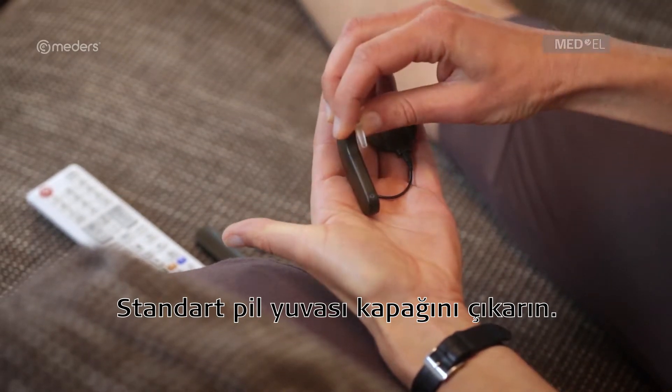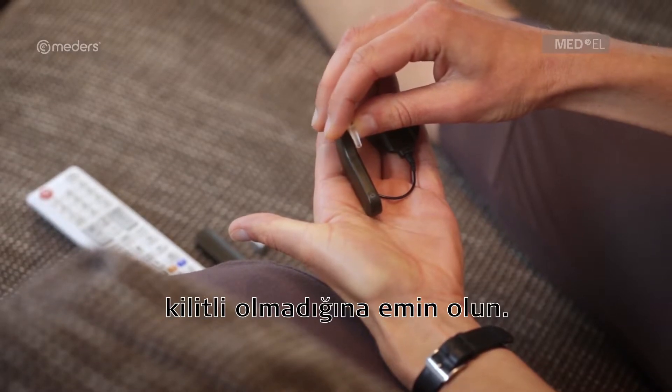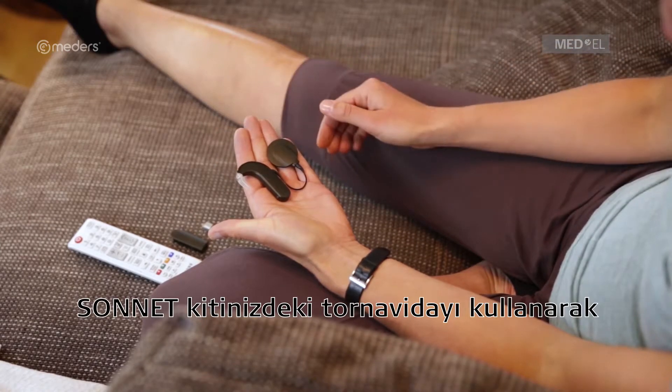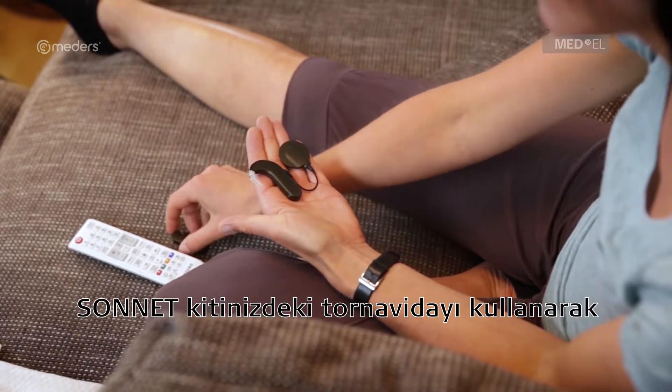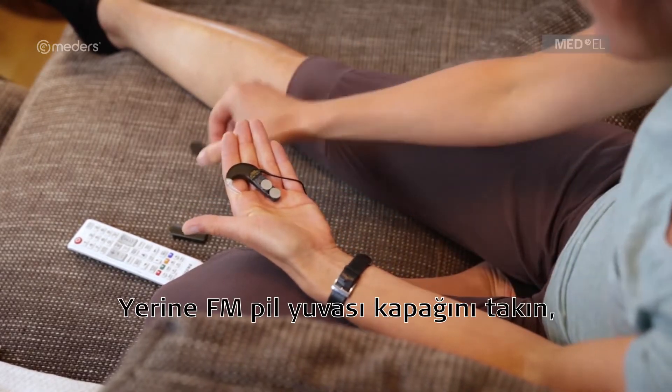Remove the standard battery pack cover. Make sure that the battery pack cover lock is in the unlocked position. If it is not in the unlocked position, use the screwdriver provided with your Sonnet kit to turn it counterclockwise into the unlocked position.